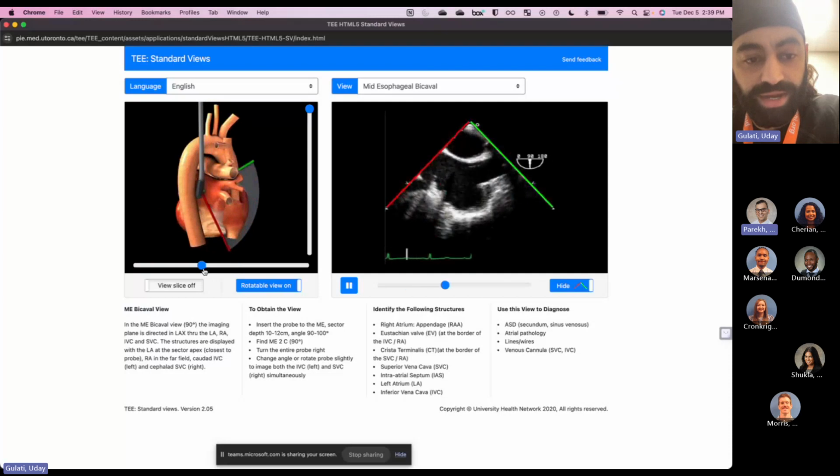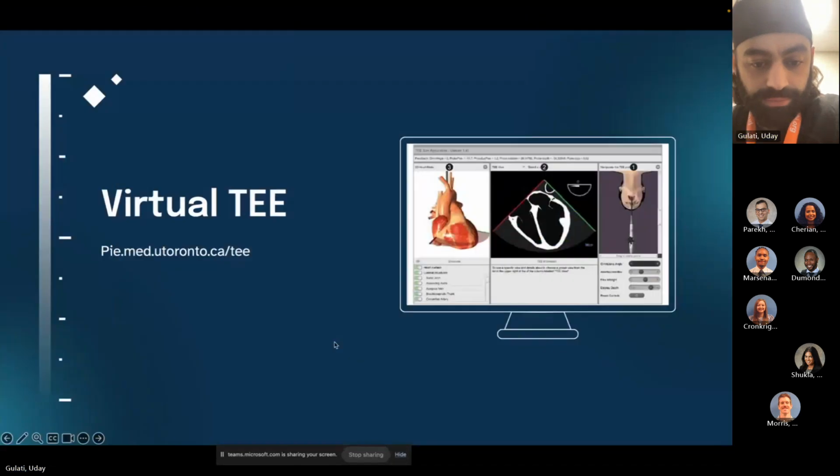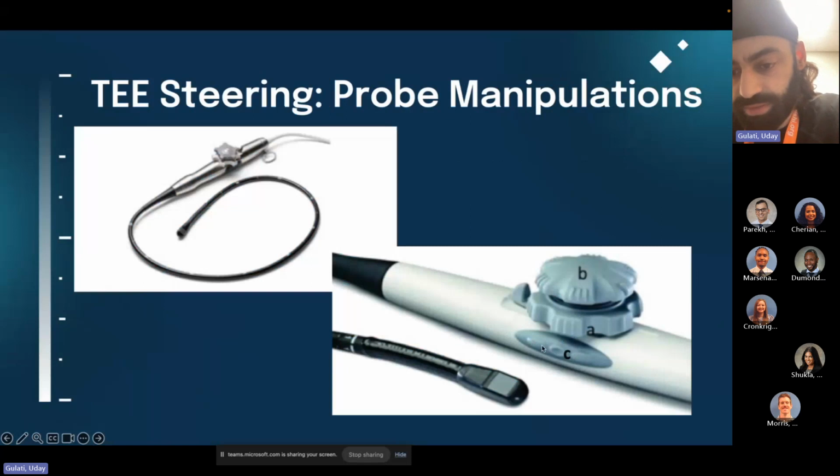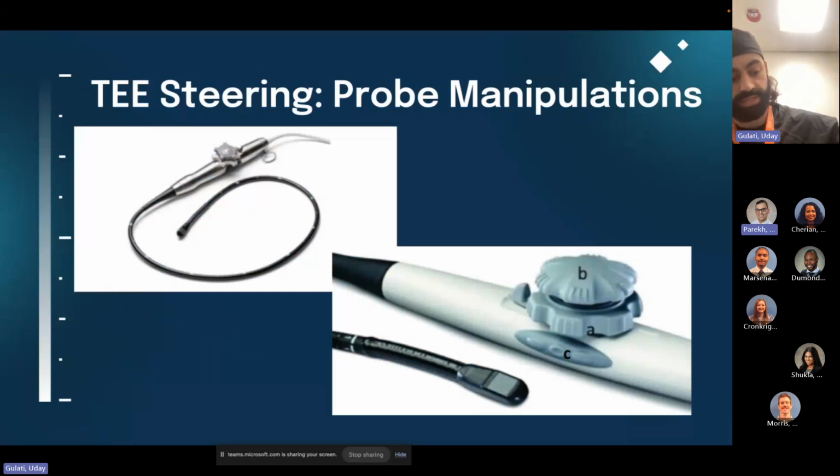Sorry, how did you rotate the beam 90 degrees? So this is this button right here. See this C button? Yeah. So when you click this close to the probe, it rotates it, so it's more positive. And then when you push it back this way, it goes more this way. So this will go towards 90 degrees. This will go towards 0. Gotcha. I misunderstood what the C was for.